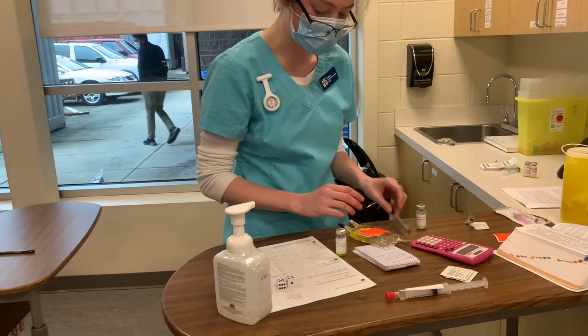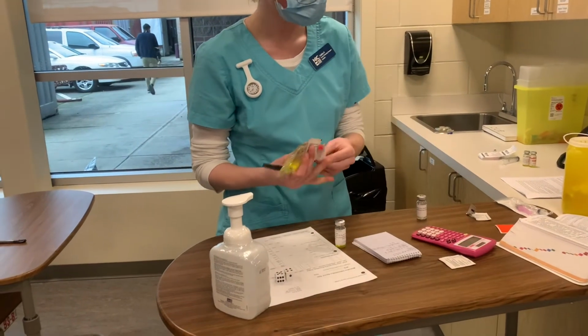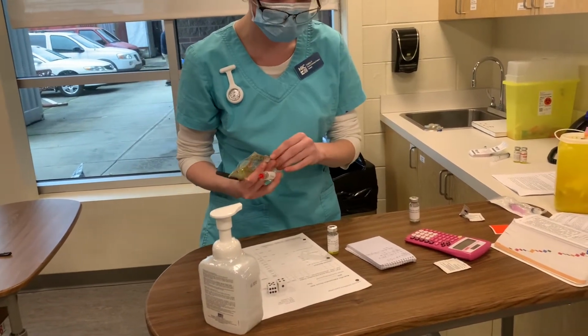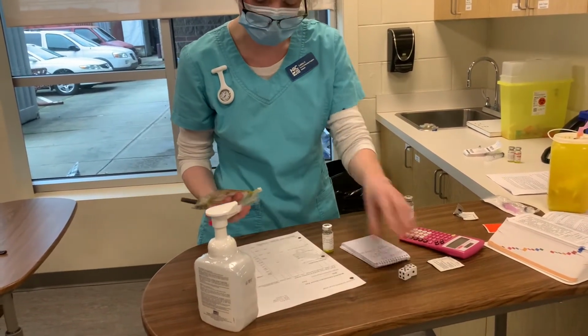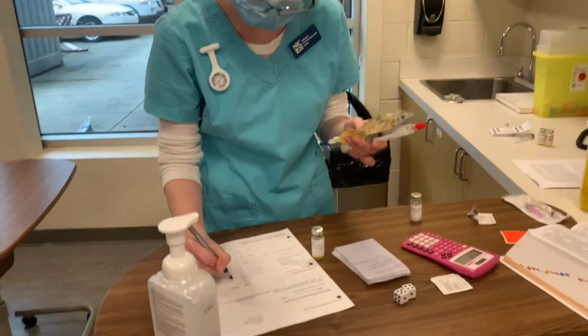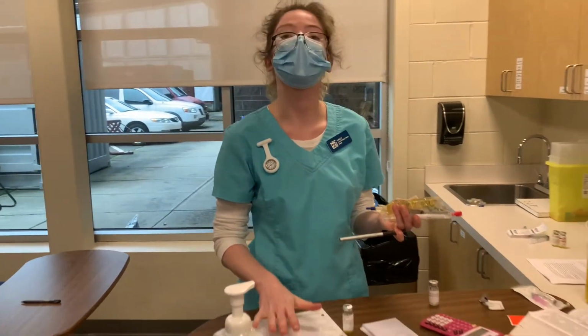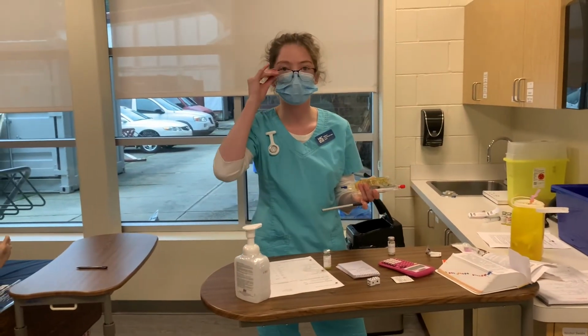And now I have my pen, sanitizer, normal saline for flushing, and I dot the MAR. And normally in practice, I would put the MAR in a drawer for patient confidentiality.